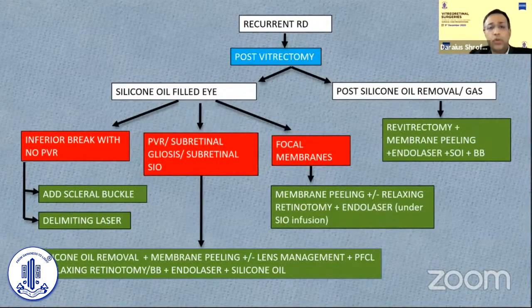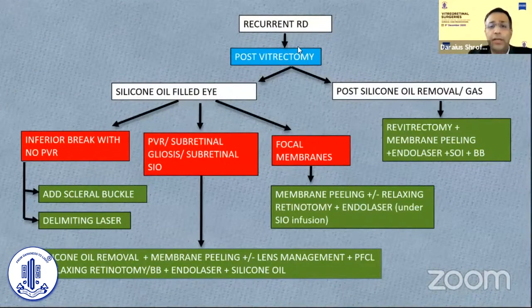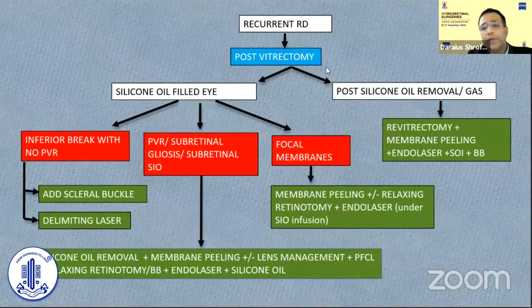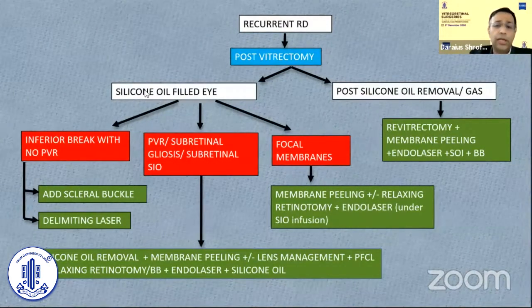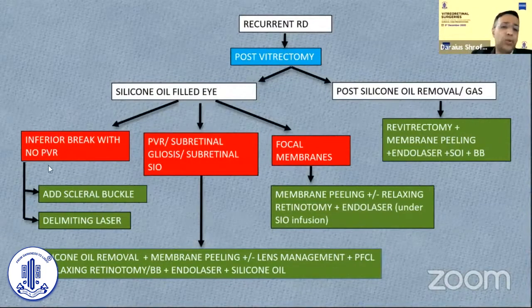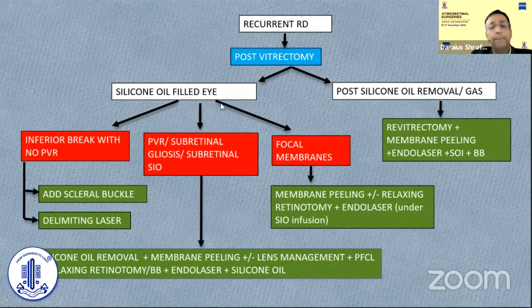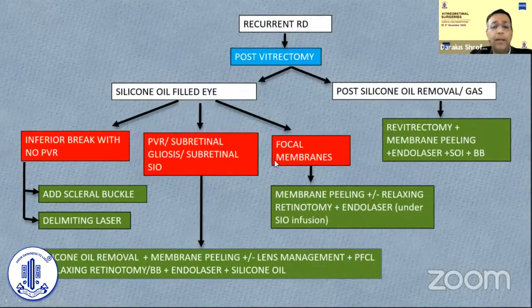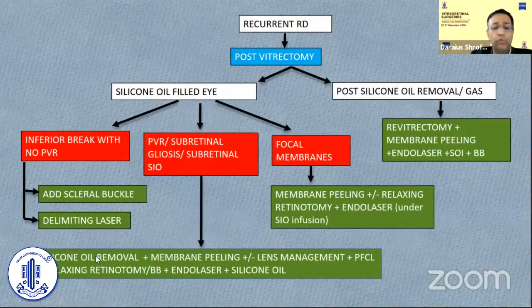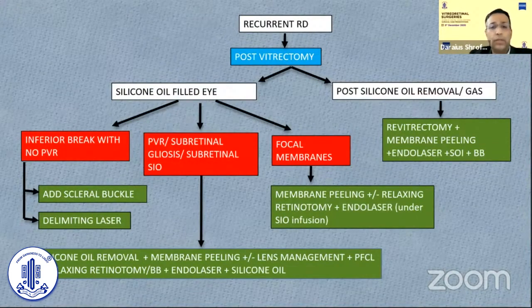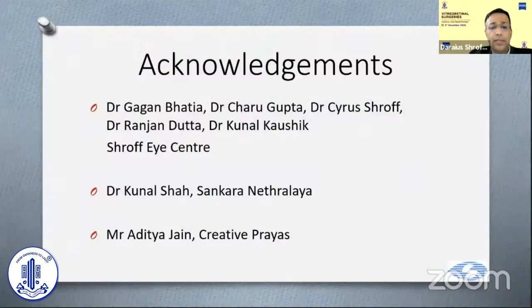To conclude: if you have a recurrent RD post-vitrectomy after oil removal, you need to do a real revision vitrectomy with all the maneuvers I described. If the recurrence is in an oil-filled eye with just an inferior break and no PVR, maybe just add laser or an inferior buckle. If there are focal membranes, you may get away with a relaxing retinotomy in that area or membrane peeling. However, if there is extensive PVR, subretinal gliosis, or subretinal oil, you need to go all the way — oil removal, peeling of membranes, managing the lens, retinotomies, belt buckle, and refilling with silicone oil. Thank you very much.